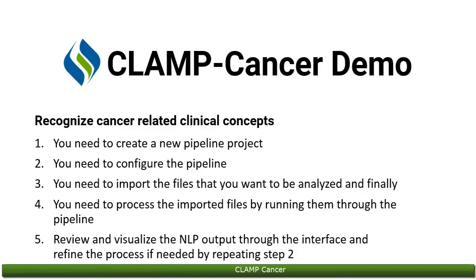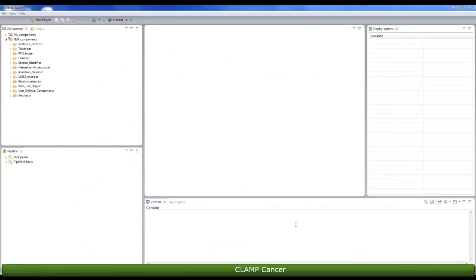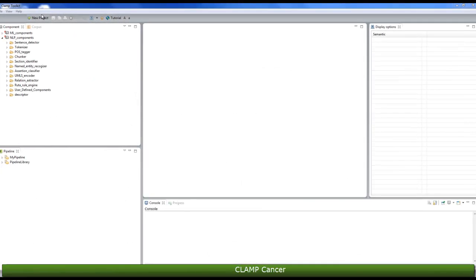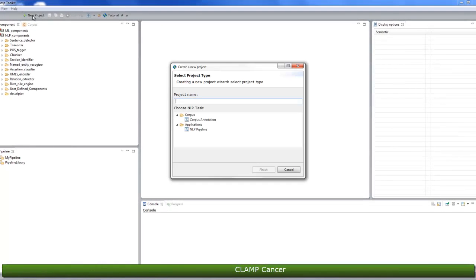Let's focus on the first step, creating a new pipeline. To do that, first click on the plus sign at the top left corner of the screen. On the pop-up window, enter a name for your project. For example, cancer demo.